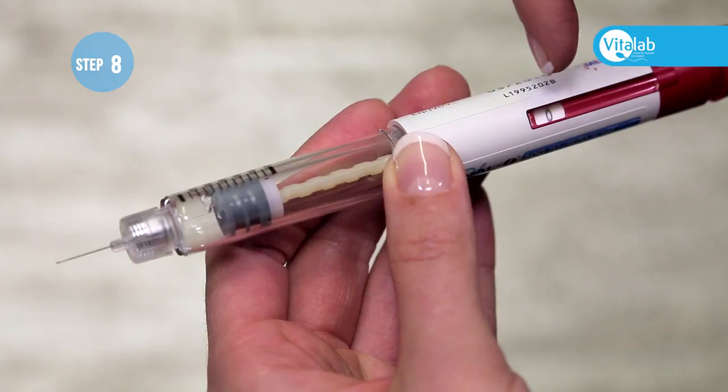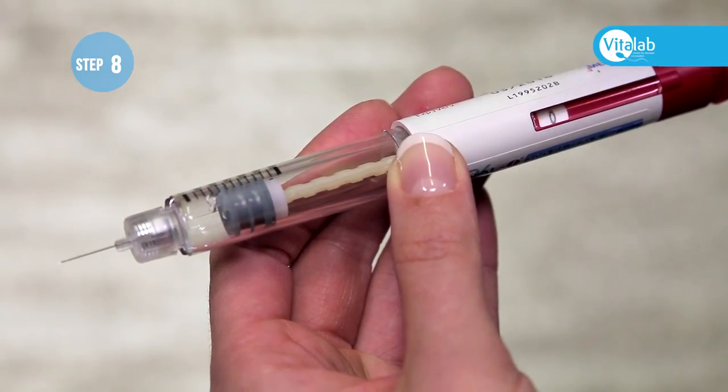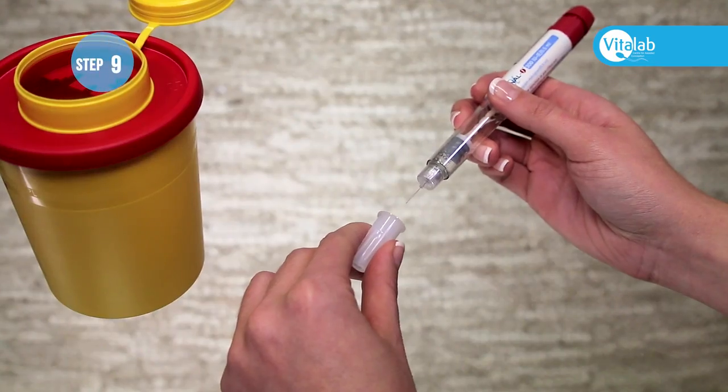The window will now show zero, meaning that the full dose has been given. Remove the needle.